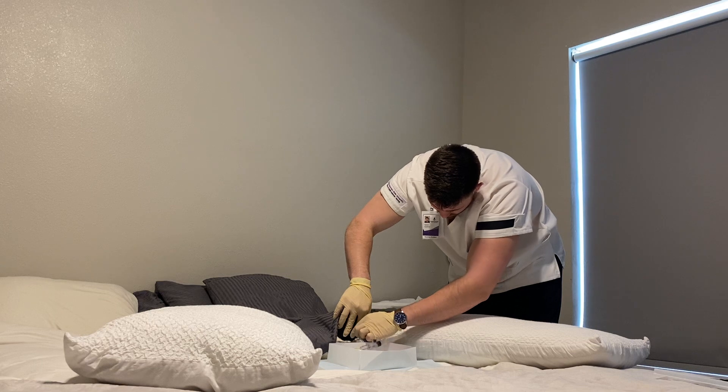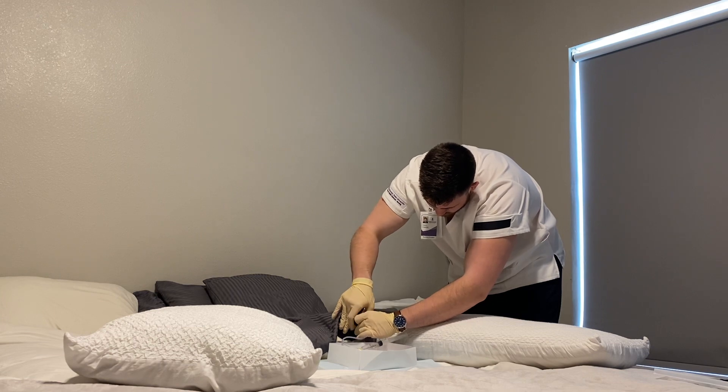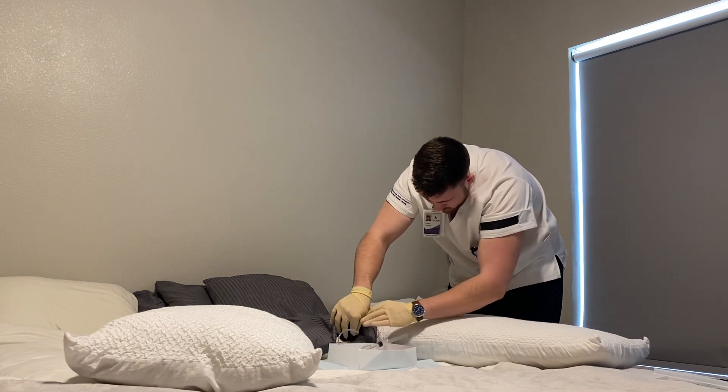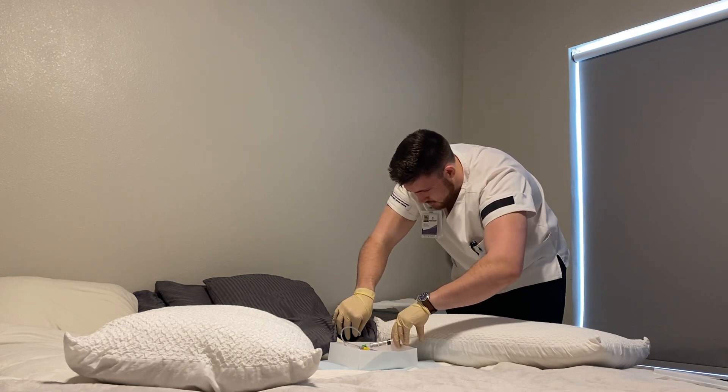Begin insertion. We see urine, so I'm going to take this hand and pinch it off, and start filling it with saline solution.